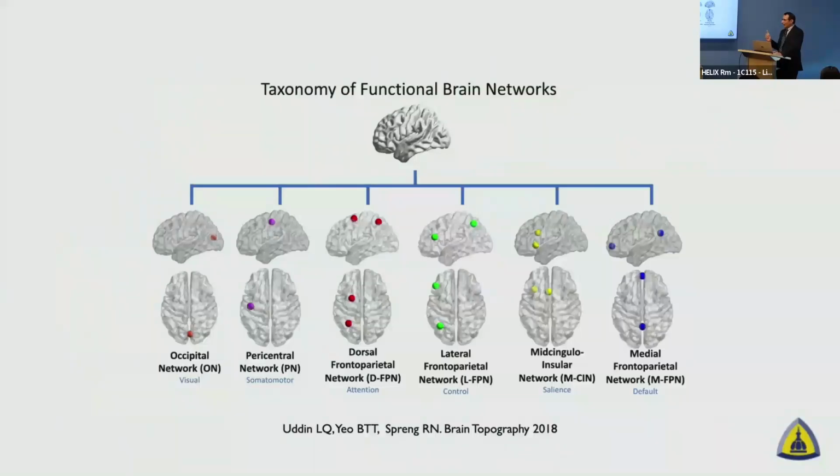One of the problems with resting state fMRI is that nobody can seem to agree on what to call these networks. So I have my own way of describing them. And there was a group, the Organization for Human Brain Mapping, that decided, because some networks everybody agrees on, but some of the other ones, if you look in the literature, are called by 3 to 5 different names. So in order to unify the nomenclature so that people can compare results, they tried to do more of an anatomic designation of labeling of networks.